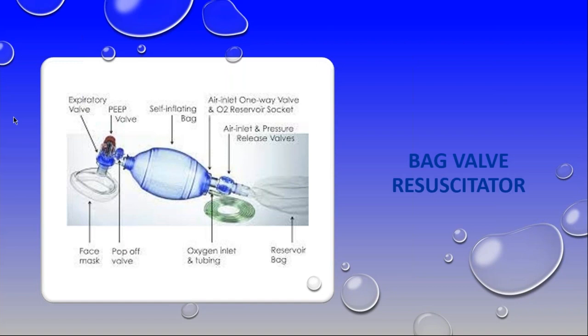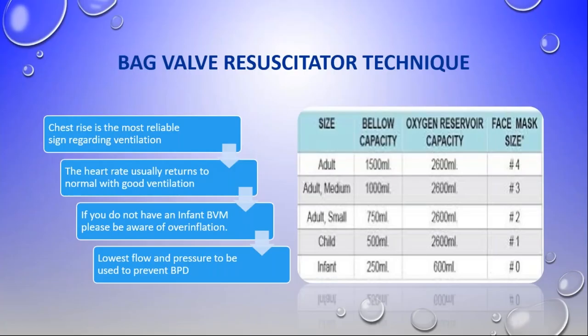And you need to only assume that every finger is 10 centimeters of water pressure. We do not ventilate babies over a pressure of 30. So we should not be using more than two fingers to move it.